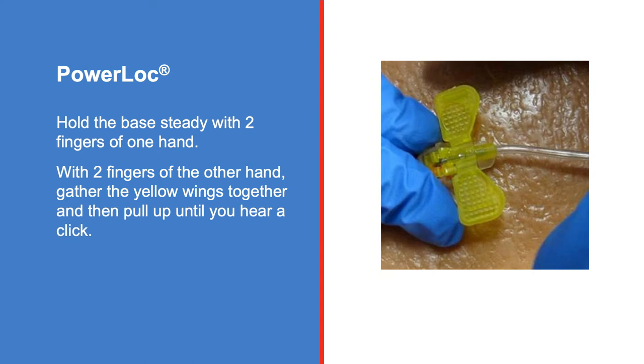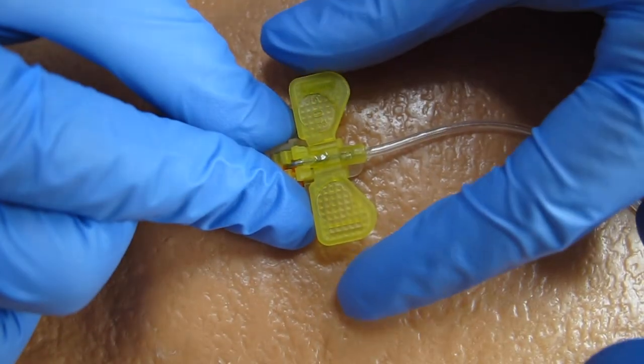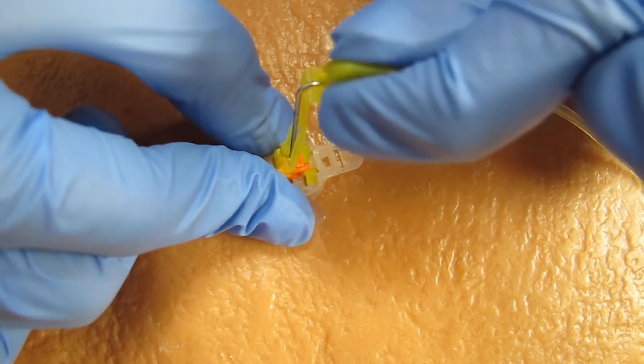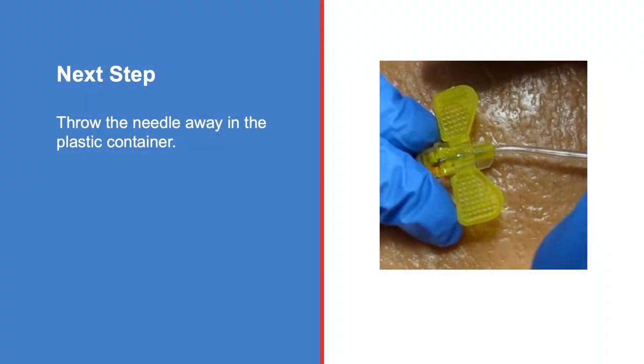A power lock is similar. You hold the base steady with two fingers of one hand. With two fingers of the other hand, gather the yellow wings together and then pull up until you hear a click. Again, you will throw the needle away in the plastic container.